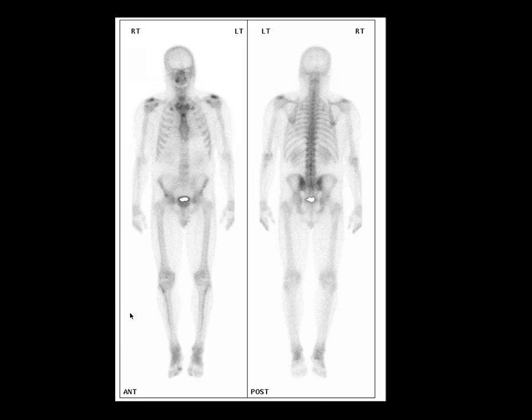Let's first point out a few sites of normal uptake. It's quite common to get a little bit of increased activity in the anterior aspect of the first ribs, as these areas are quite close to the gamma camera. You can also see quite prominent uptake in the sternoclavicular joints as a normal finding, providing they're symmetrical. The coracoid process and prominent but symmetrical acromioclavicular joint activity are also normal.